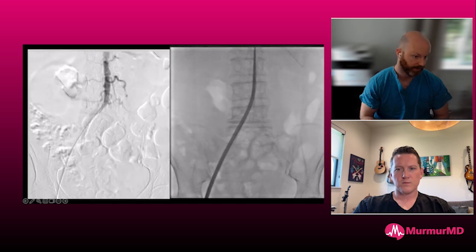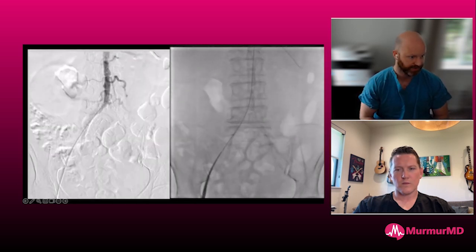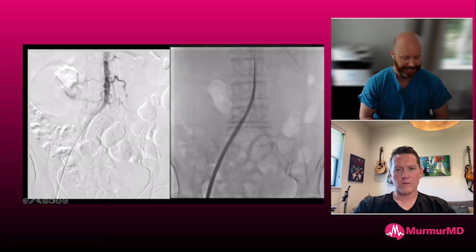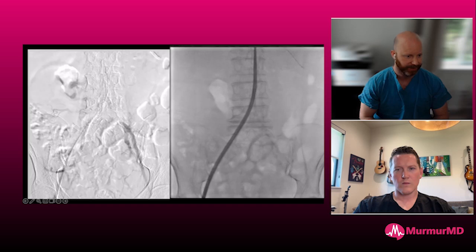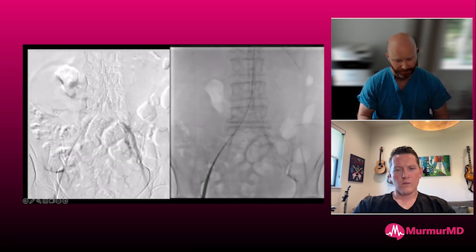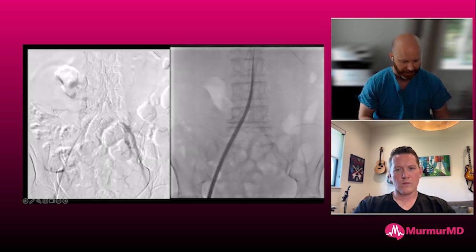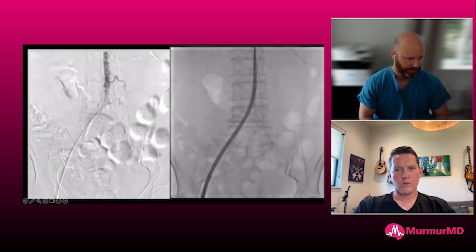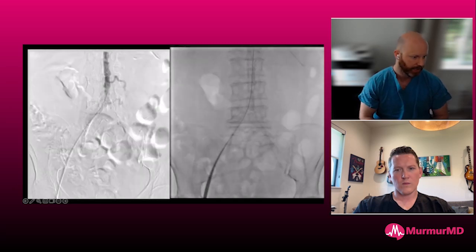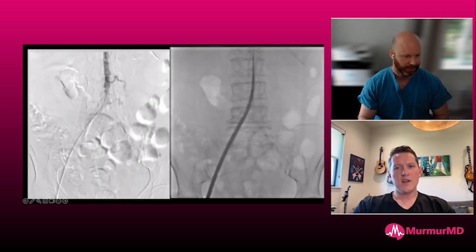You can see here this sheath goes with limited to no resistance. We're on a stiff wire, of course. We always implant on stiff wires for all of our sheaths. And if you need to, you can dilate with the other peel away sheath dilator. It has a hydrophilic coating on it that can lubricate the path. You can take that out, and then your peel away sheath, which also has a hydrophilic coating on its dilator, and the peel away sheath itself can then pass a little bit easier if you need that. So if you need to dilate, I normally dilate with the other peel away dilator because I find it's actually a really good product. So we went ahead and did that here.